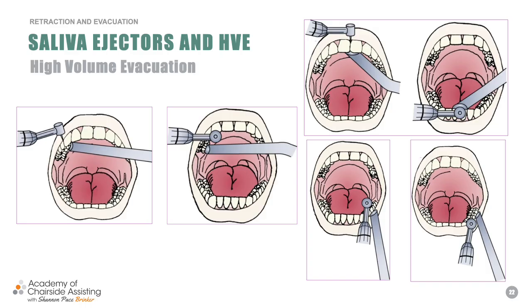And on the mandibular arch or the lower arch, guess where my suction is? Right behind 22, 23, 24, and 25, right? I'm going to be just kind of going back and forth in that area. But again, if there's a cotton roll there, you really can rest on it. Just make sure you don't suck it up, all right?